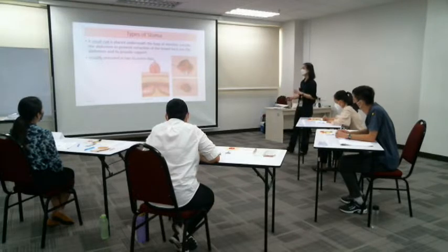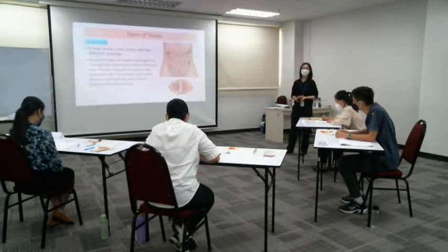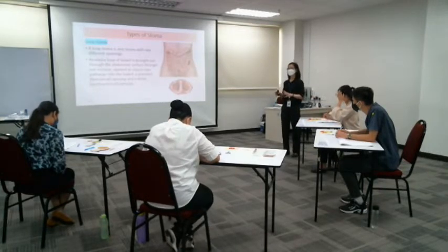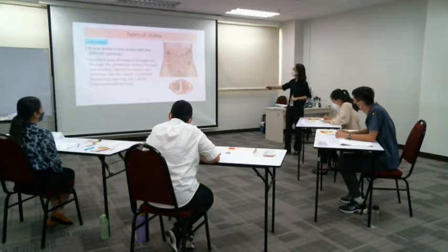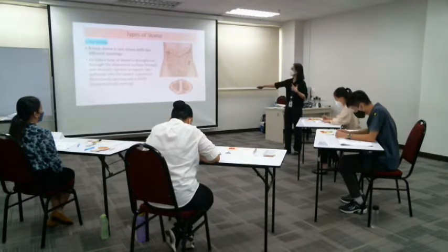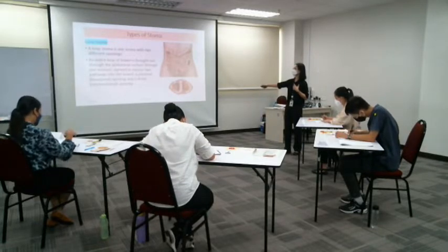When you have two openings like this, it is very important to identify which one is proximal and which one is distal. If you look at the colon, it runs from here, transverse, and then descending. The first hole here that is close to your body is called the proximal loop. The proximal loop will be the functional loop. Feces come out from the proximal opening.